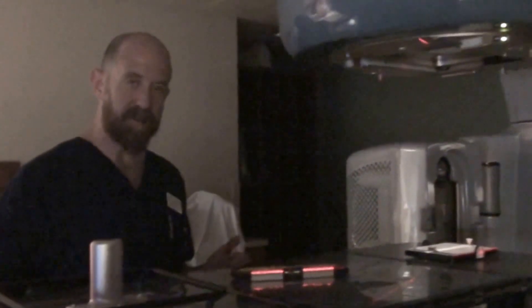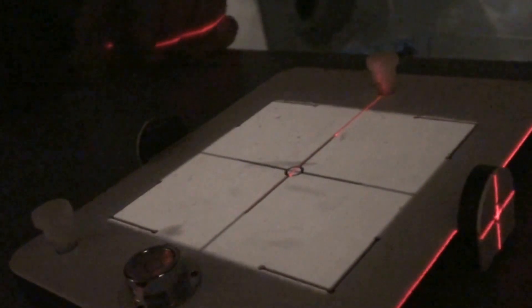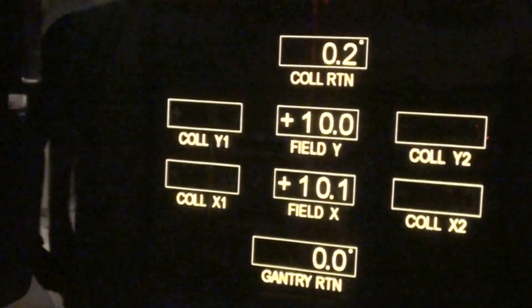Field size is defined at isocenter. So now we can check the field size. What we want to do is change the field size until it aligns with the field size marks right here — do the best of your ability to line up the field light until it aligns with the corner edges. That should be 10 by 10. Now we can look at the digital readout — we're within tolerance. What we visually set as 10 by 10 at isocenter reads 10 by 10 on the digital readout.